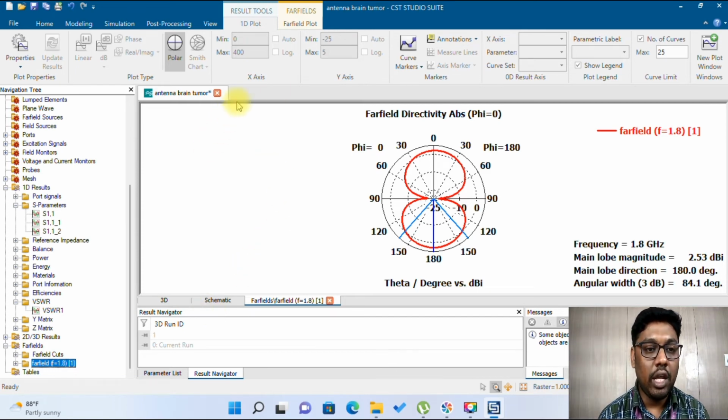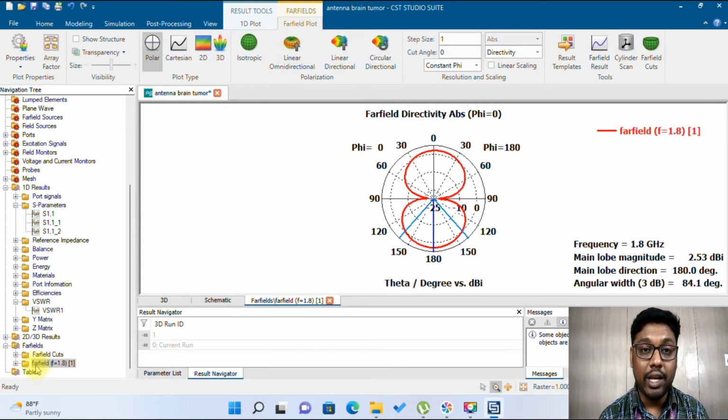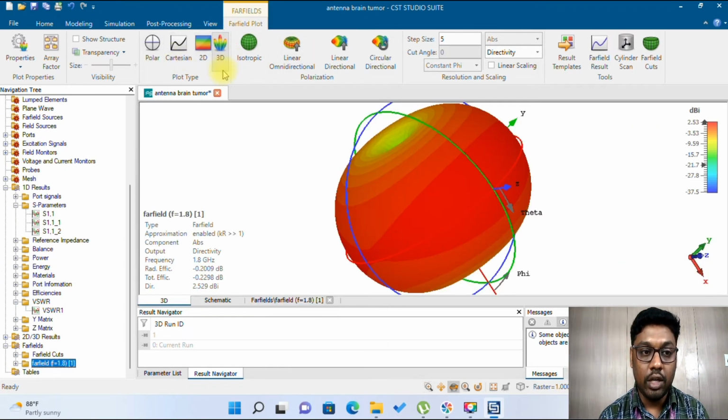Okay, so here I can show you this. In the far field I have already calculated the far field with F equal to 1.8, because 1.8 is my resonant frequency according to the design. So once you click on that, in the far field plot, you can see that we have an option, 3D plot. The 3D plot will show you the three-dimensional radiation pattern, and here you have an option in the toolbar. You can switch between gain, directivity, all those stuff. I initially selected directivity, and you can see that the directivity is around 2.5 dBi, and if you want to see the gain, choose the gain option over here.